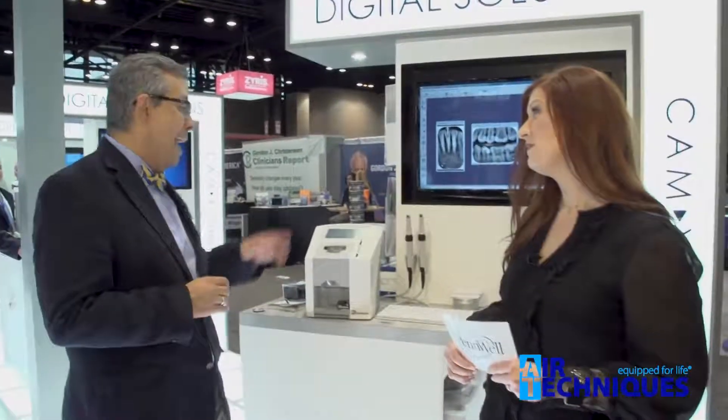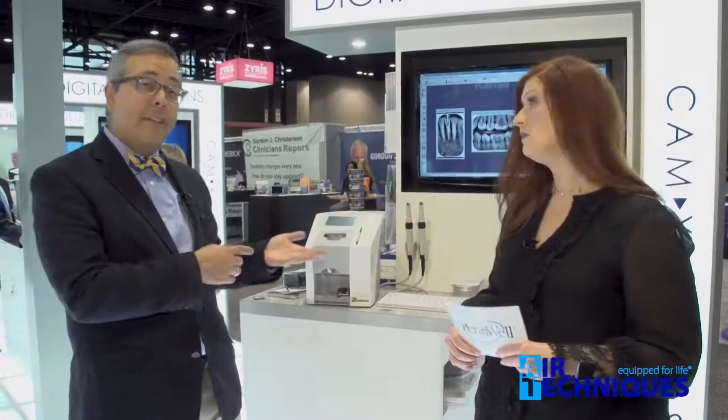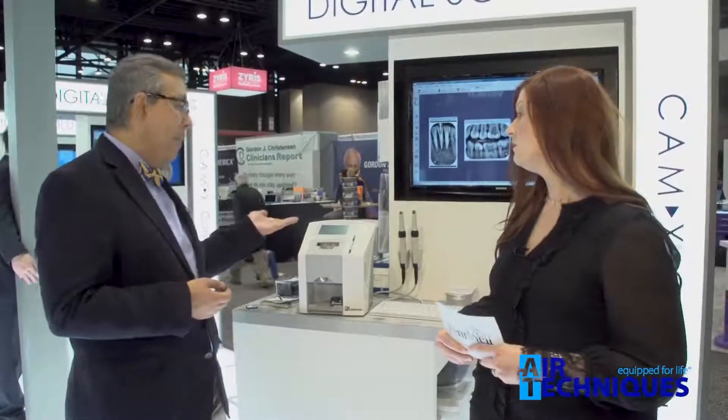Easy to place in the patient's mouth, very comfortable, easy for my staff, easy for the parents, and probably the most important part, easy for the patient. I'm using the old system and I'm just crossing my fingers that I can use this, because one of the big advantages of the new system is it can be wireless — no more cables — and again, it's very user-friendly.